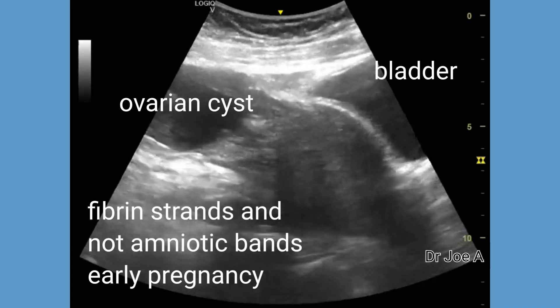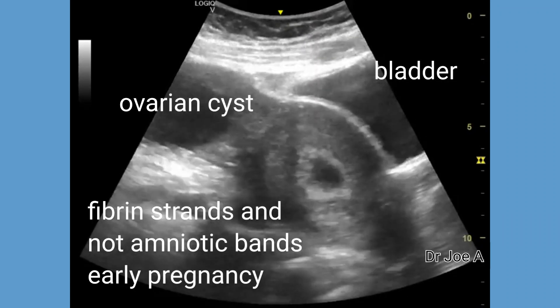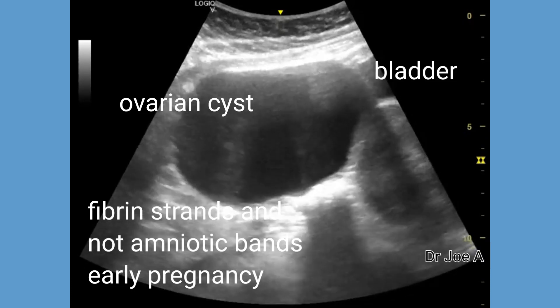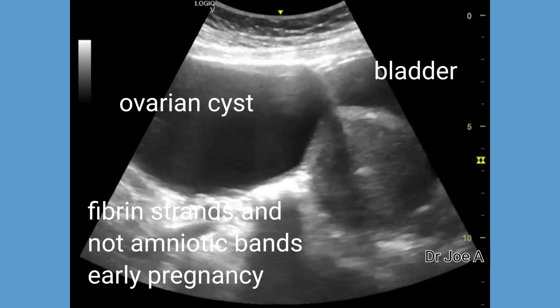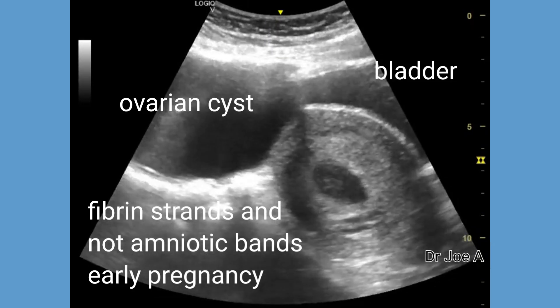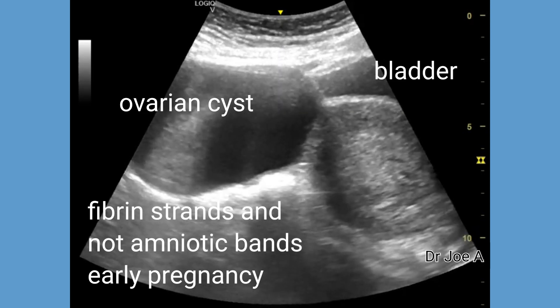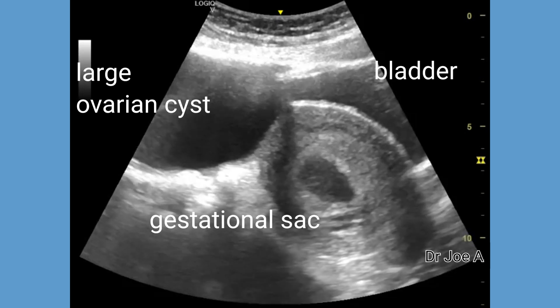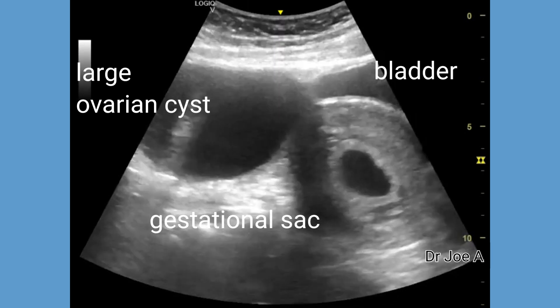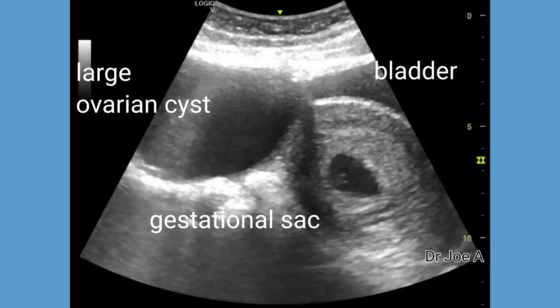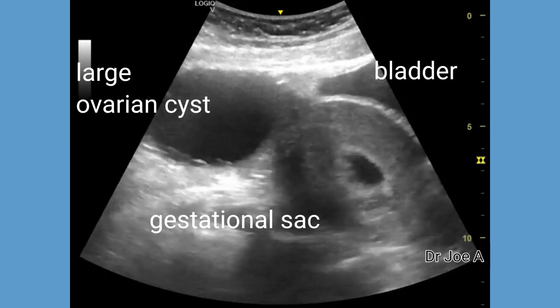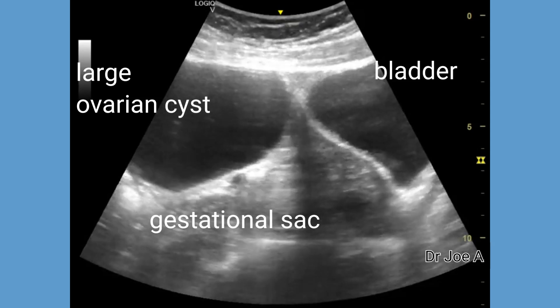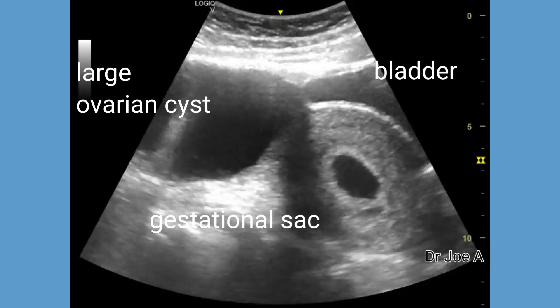This is a case of an early pregnancy on which we did a trans-abdominal scan and found a huge ovarian cyst. Trans-vaginal ultrasound revealed an extra interesting finding. The ovarian cyst is huge and aseptate with no evidence of any particulate matter or septa, and is seen above and posterior to the fundus of the uterus. Trans-abdominal ultrasound also shows a normal gestation sac with a viable embryo.